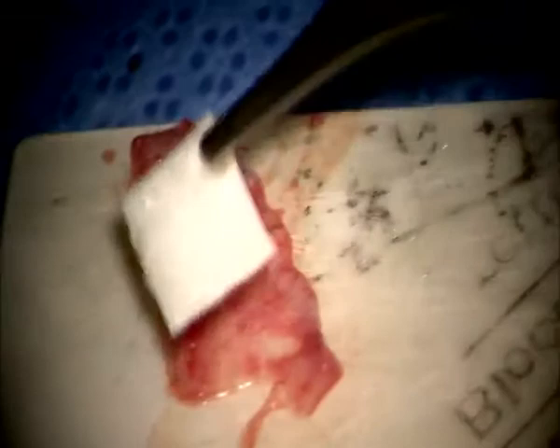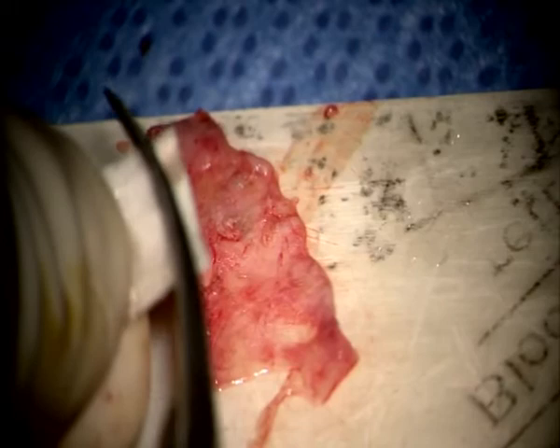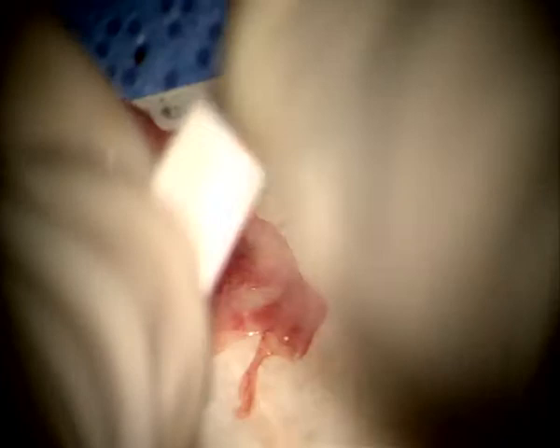Give me scissors. I need globs of polysporin. You have globs? I need a lot of polysporin. Is there a lot of polysporin on it? Fusidine, whatever. Put it here.